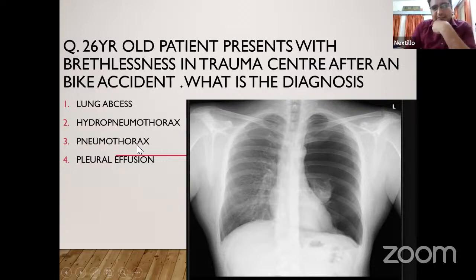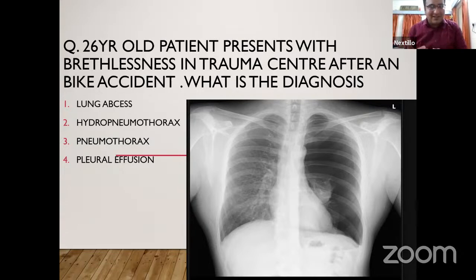Pneumothorax. Pneumo means air, and thorax means there is air between the pleural cavities. This pleural cavity is filled with air, so the answer will be pneumothorax. Some students are marking pleural effusion, but water will appear whiter than air. Water is comparatively dense, no? It will appear white. That much is pleural effusion.